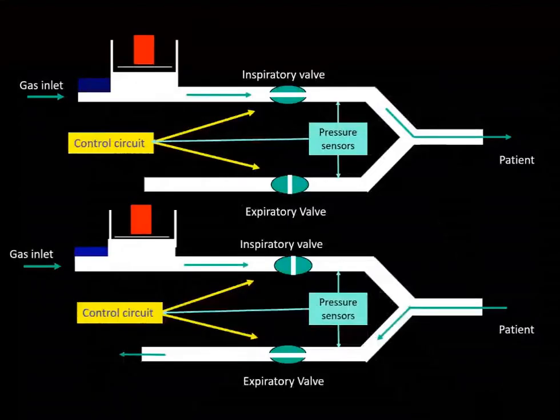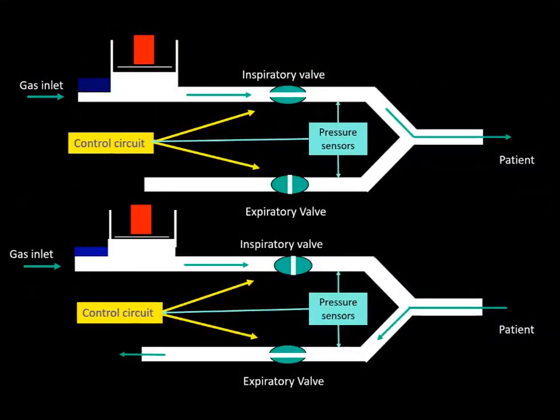So in essence, we also have to keep in mind that the only physical entity which the ventilator can modulate is flow. This is something we should never forget.